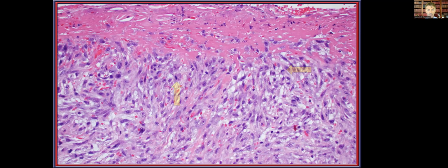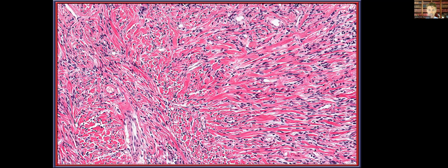Polypoid type appearance to it, you will notice multiple different aggregates of the neoplastic cells, quite cellular, so it usually has a very blue overall appearance. Recognize that surface ulceration and denudation is common in the sinonasal tract or the oral cavity or even the larynx, and so you may have mitotic figures immediately below the areas of tumor ulceration. This should not be an area where you're going to try and count mitotic figures. As you know, there's a risk stratification for solitary fibrous tumor as a whole, and I would definitely not recommend counting mitoses so close to an area of denudation.